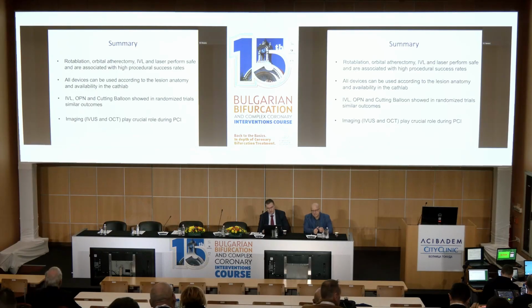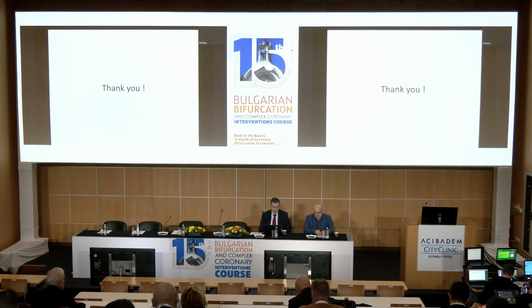IVL, OPN, and cutting balloon showed similar outcomes in randomized studies, but this was just to show that all these devices are really effective. And as I showed you in a few slides on imaging, IVUS and OCT play a very important role during PCI to plan and to optimize the final result. Thank you so much.